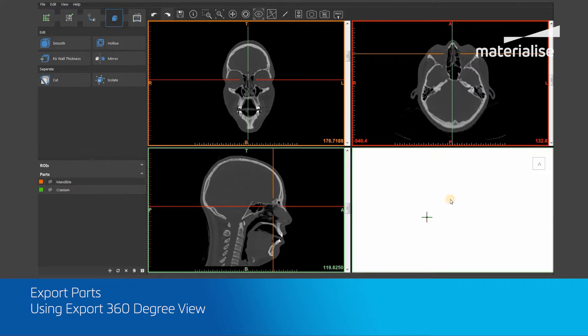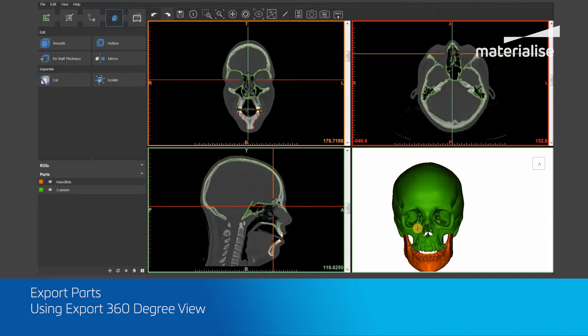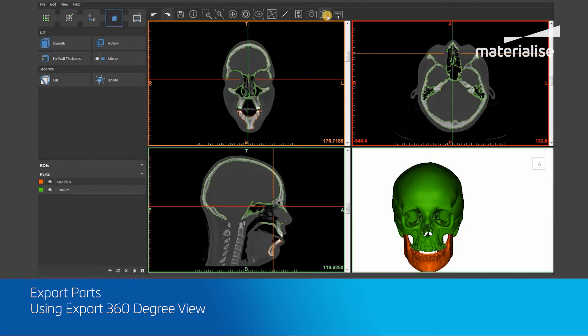Next, I will click on the Export 360 Degree View tool in the general toolbar to take a set of screenshots of all parts that are currently visible in the 3D viewport.